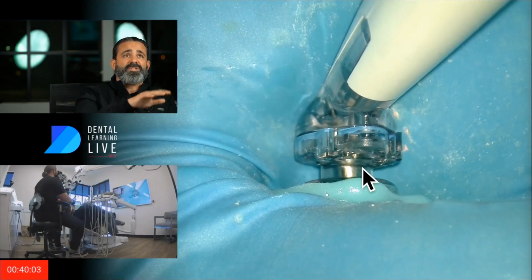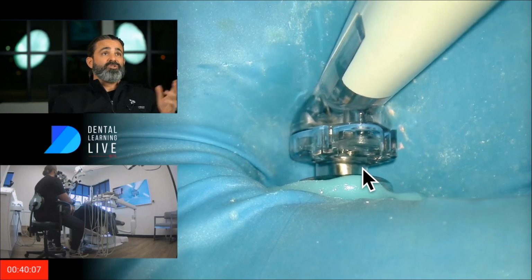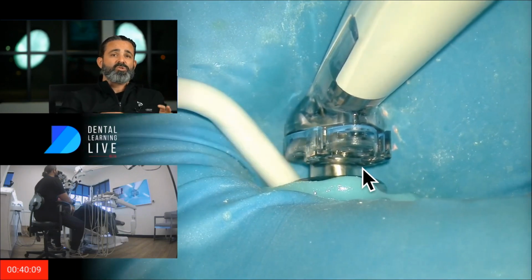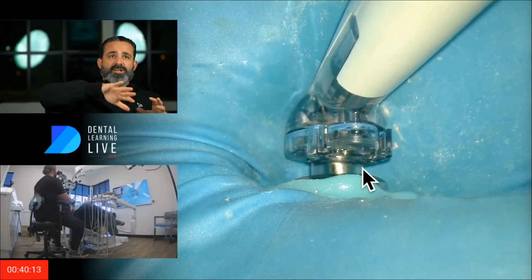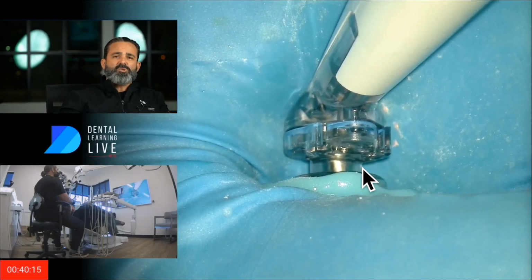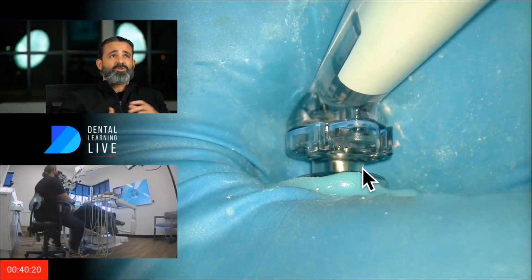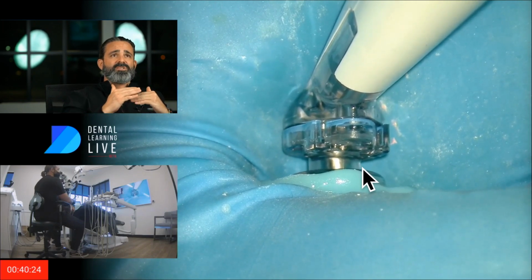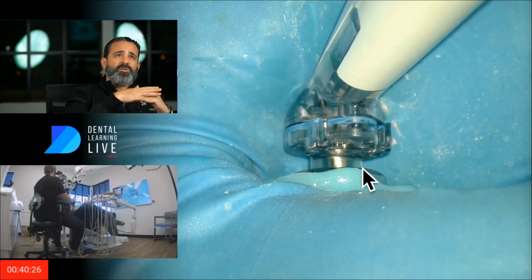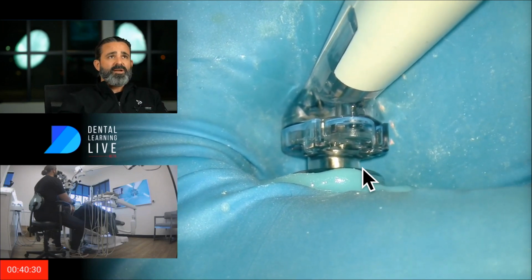I just started drifting. And sometimes I found, if your chair's not locked and you're doing that kind of stuff and your chair is really loose like mine, you can actually drift the patient's chair away and you'll get these sort of natural elevations. And so that's why it's really recommended. That's just human. You're just a human being. So it's really recommended, don't freak out if that happens. Just suction and then just sort of re-posture on that and see if it just reestablishes itself.